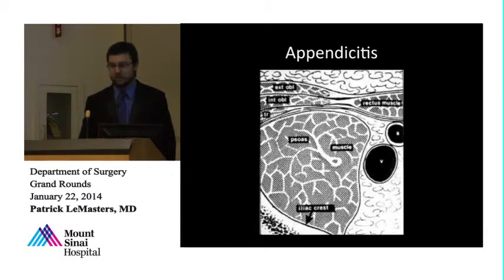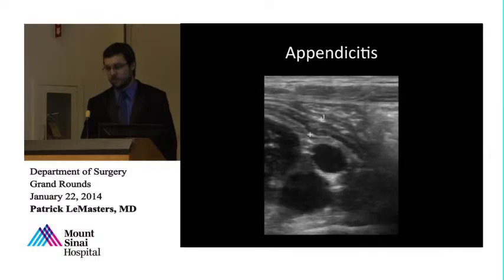So I want to review the anatomy, and this illustration shows what I look for every time. This is kind of my home base when performing ultrasound of the right lower quadrant. You can see the iliac vessels here, the psoas lateral to it, and this is a spot you can go back to every time, and I consider this home base. If you get lost looking in the right lower quadrant, you can go back to there. What does this look like on ultrasound imaging? Here you go. You can see your iliac vessels, the psoas, and here you can actually see a normal appendix passing over it.